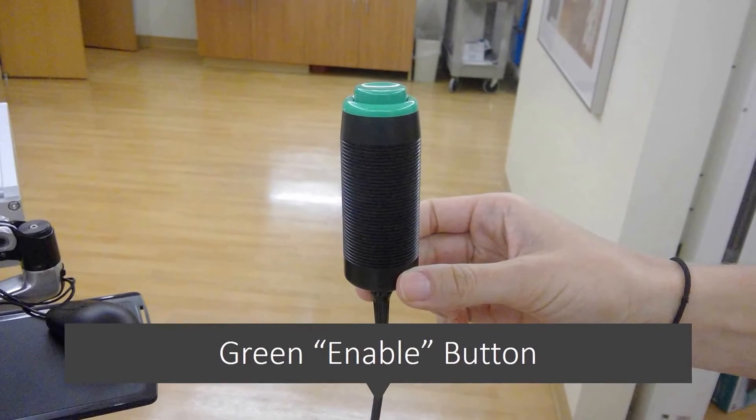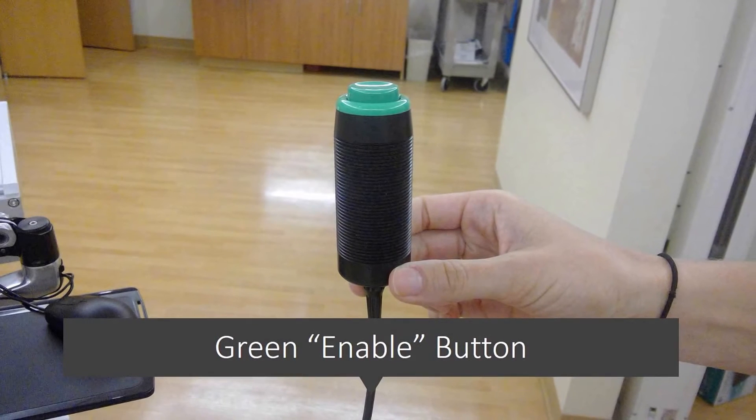This button is what puts you in charge of the whole process. When you are ready to begin, the therapist will instruct you to push the button in. This alerts the ABC system to start. The therapist will then instruct you to take a few normal breaths followed by a breath hold. When you reach threshold under a deep breath in, the system will aid you in staying at that level until you let go of the button and the system releases and you are able to breathe freely.